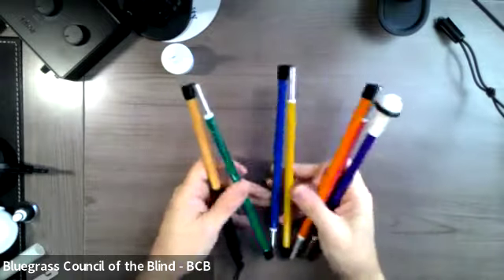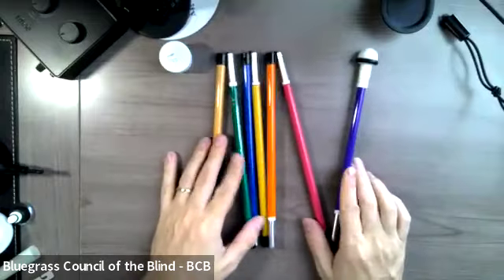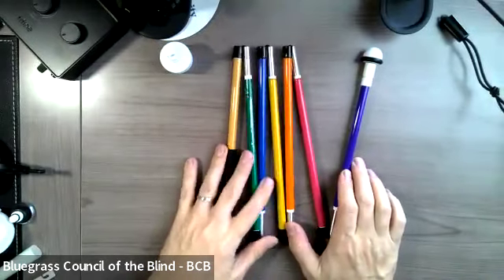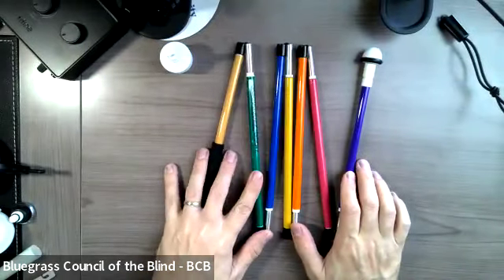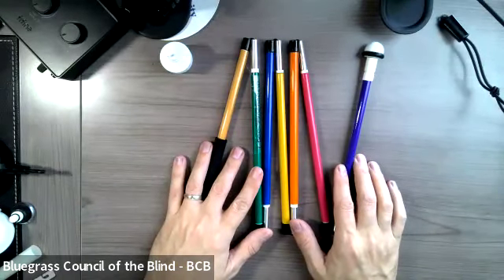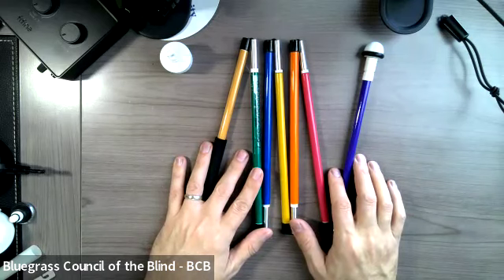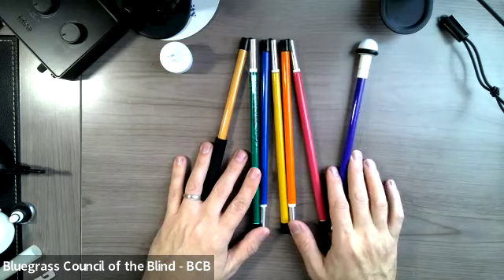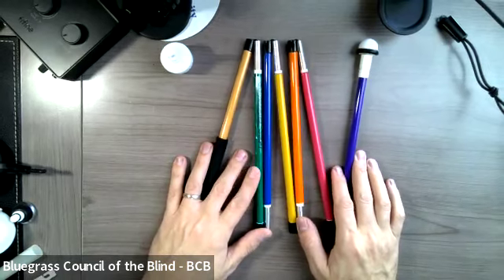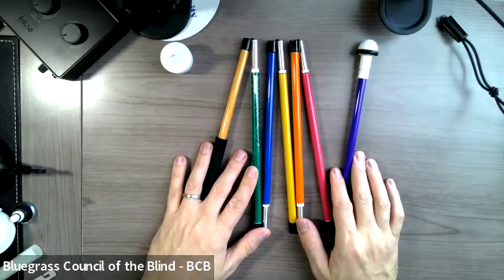So this has all the different colors that you can get your cane shafts or different sections to be. And you could do multicolored, like this one would be kind of a rainbow colored cane, but you could also get a solid blue or maybe half black and half red or whatever you want to do. So there's blues and greens and yellows. They even have textured patterns. There's a color called marigold. You can even get multi-red section canes if you want.